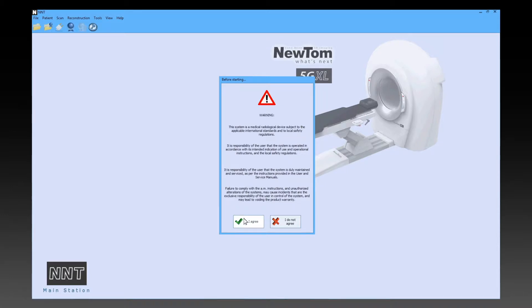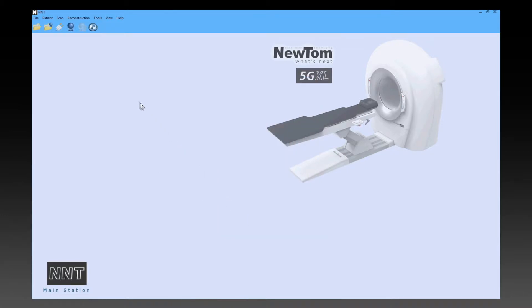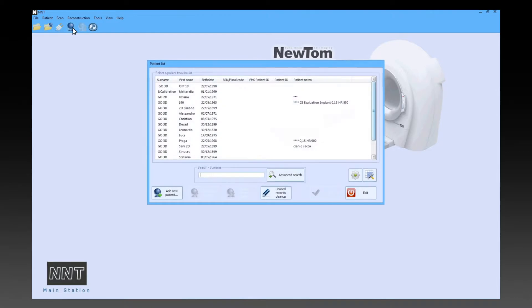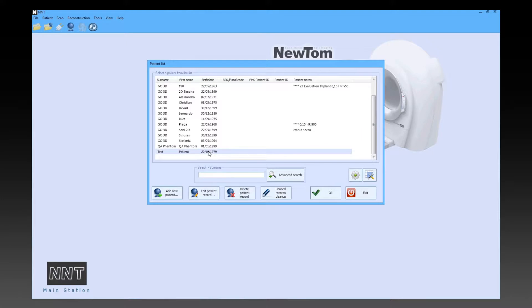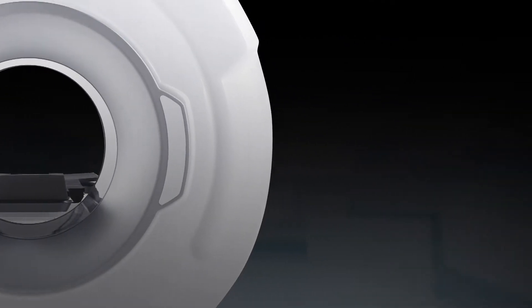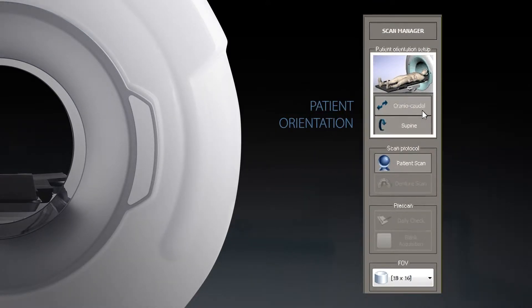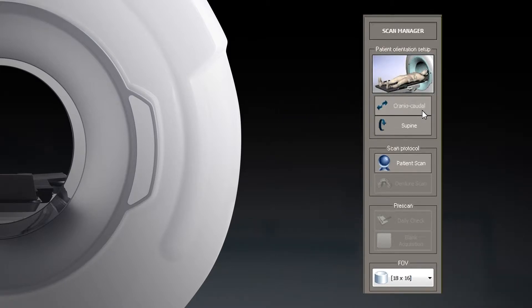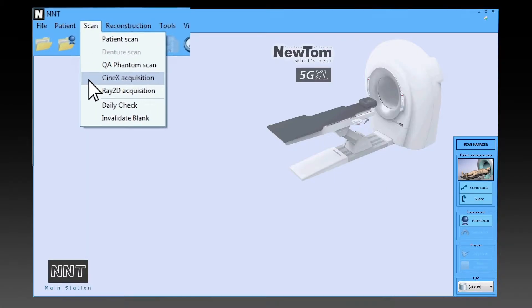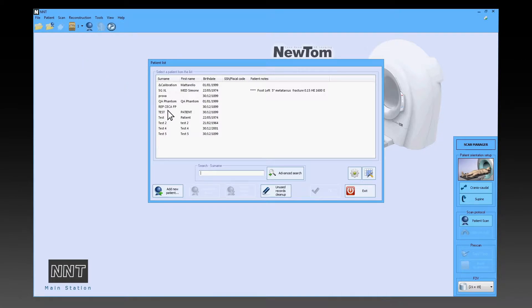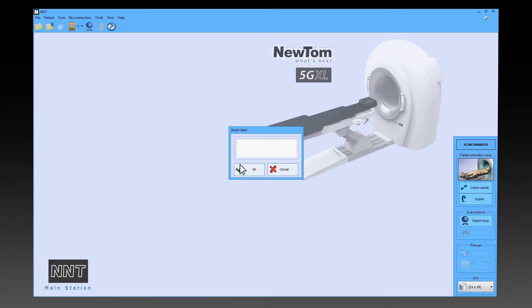After welcoming a patient, her folder can be retrieved from the patient records or a new entry can be made from the special screen page. Afterwards, the physician uses the scan manager window to submit to the software the patient orientation on the table. Using the scan menu, select CineX acquisition and then the capture parameters.